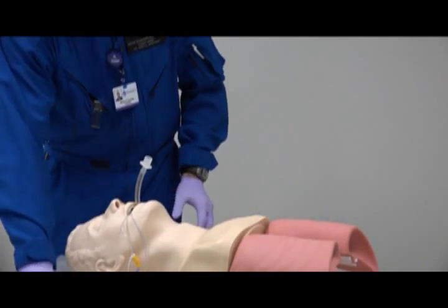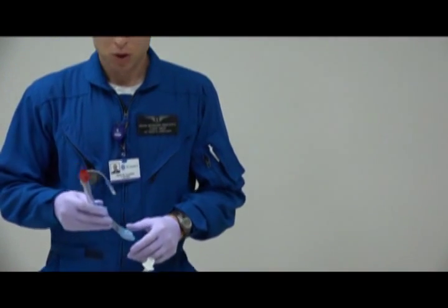I hope this was helpful with showing how we can switch out the King LTD into an endotracheal tube successfully. Thank you very much.